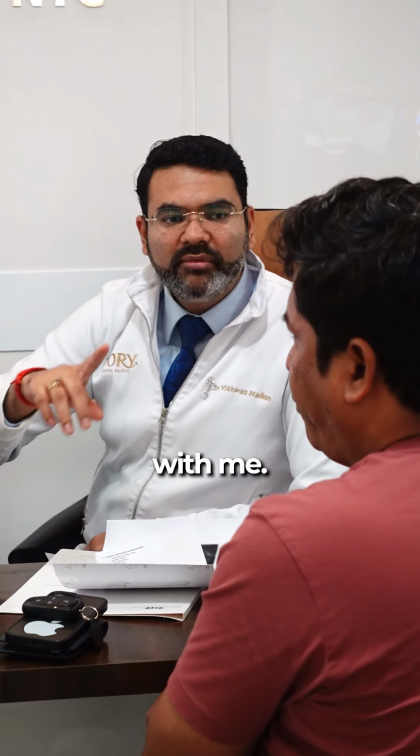So let's see how we do the implant planning of our patients at Ivory Dental Clinic. First, the patients come for a consultation with me, that is Dr. Vishwas Madan, an implantologist having 13 years of experience in implants.